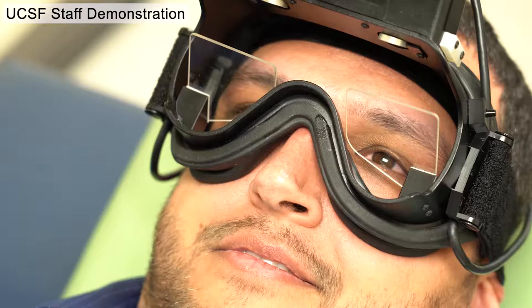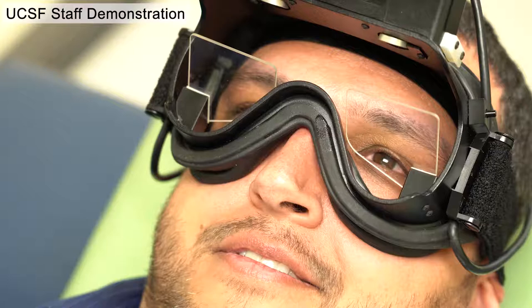During a video nystagmography test, you'll wear a set of infrared video goggles that will record your eye movements throughout the test. The lights are on in this demonstration, but the actual test is done in the dark.